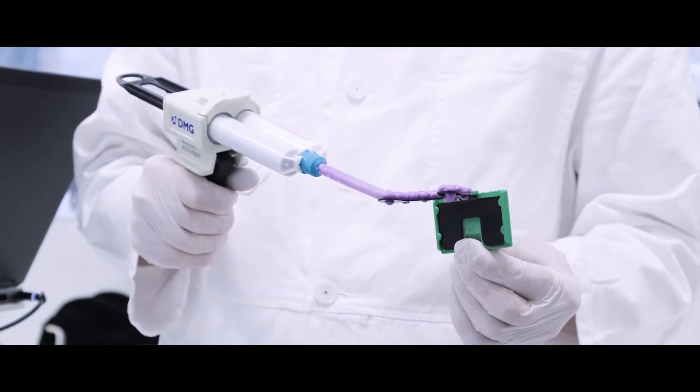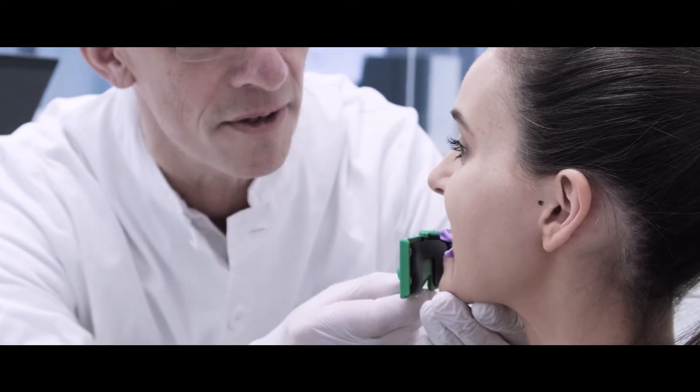A system called transfer fork is used to relate digital models to the patient's face.